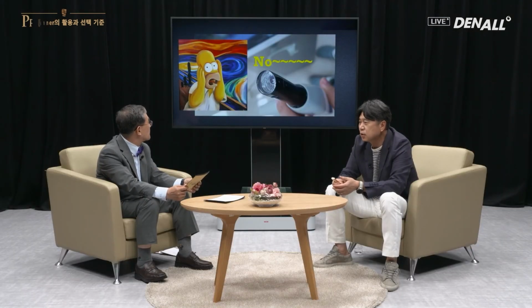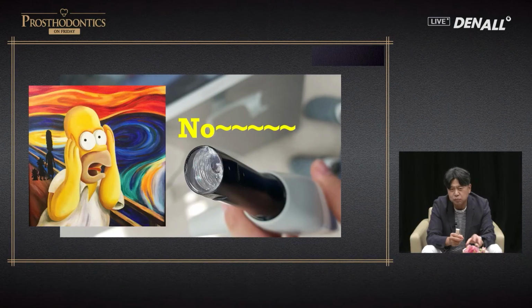So you need to consider these factors in choosing one, but you need to be careful about one thing. You should never drop it. If you drop the scanner, usually the frontal part is heavy, so it can easily get broken. It is very costly to get it repaired, and it takes a long time to get it repaired.